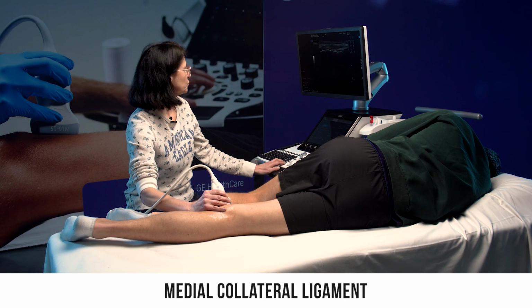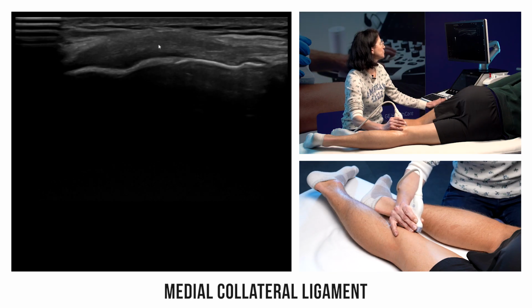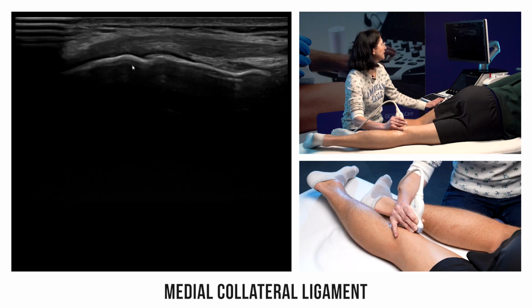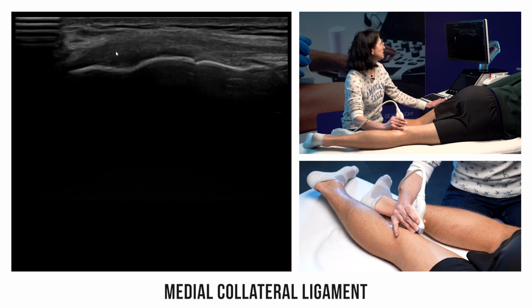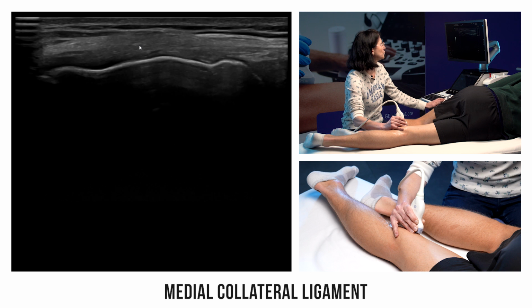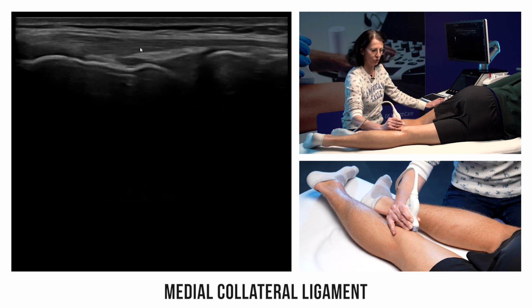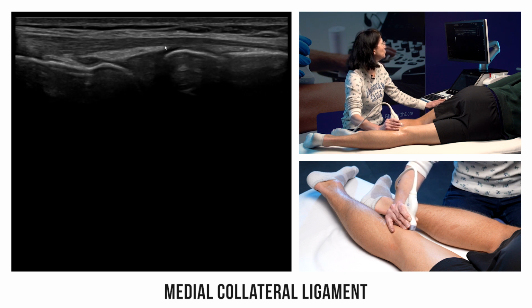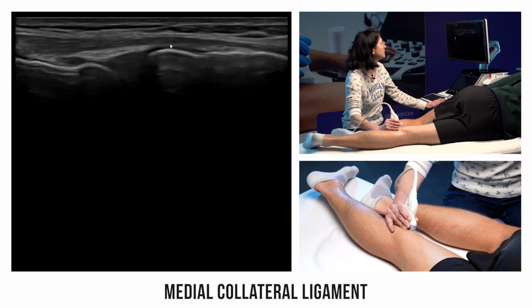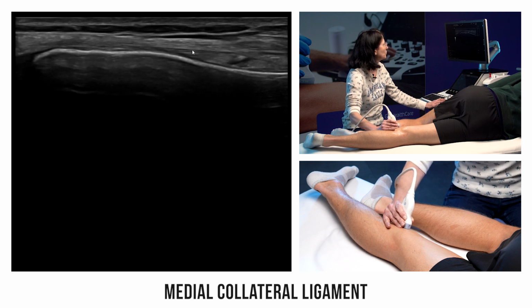The superficial portion of the medial collateral ligament is much thicker than its deep portion, very fibrillar and hyperechoic when normal. It inserts above on the medial epicondyle and slightly behind it, where it is relatively thick. Starting at this point, on a coronal view, we can slide the probe over the entire length of the ligament, which, you will see, continues very far down, below the medial tibial plateau.